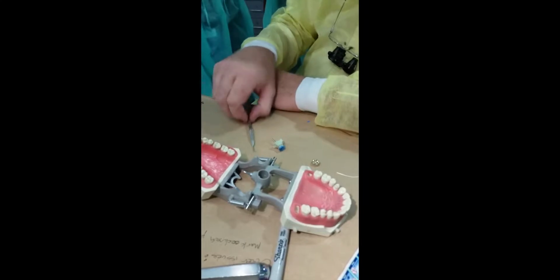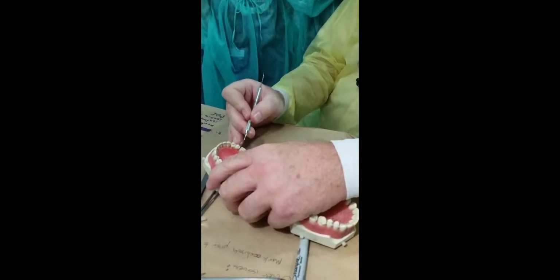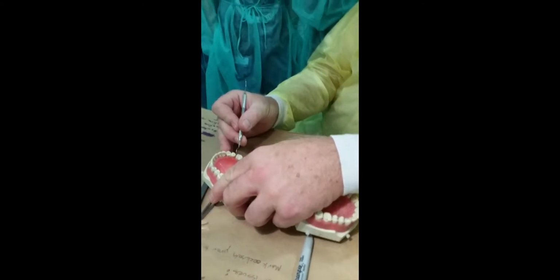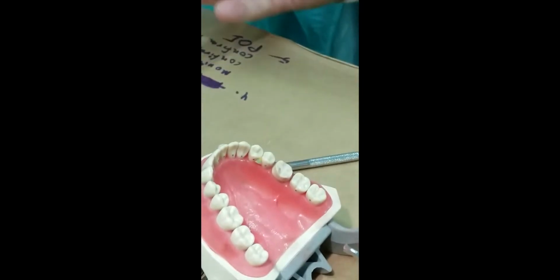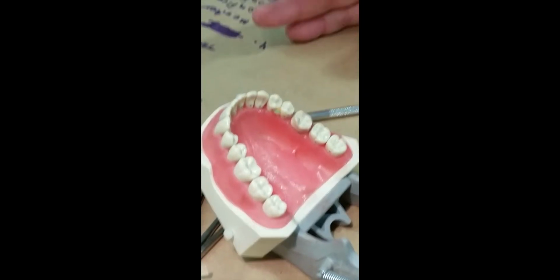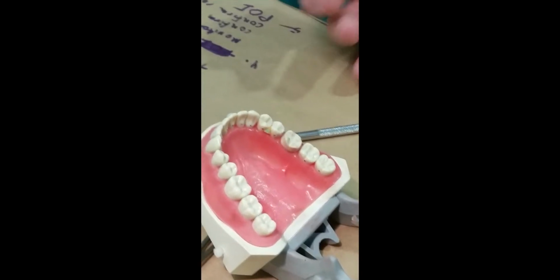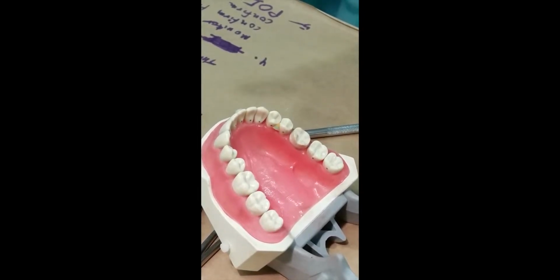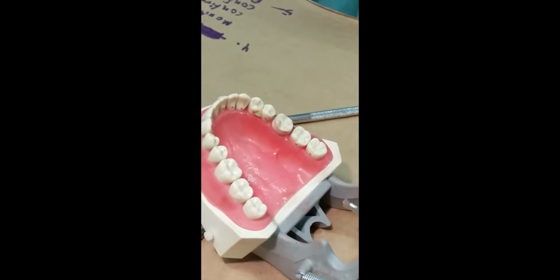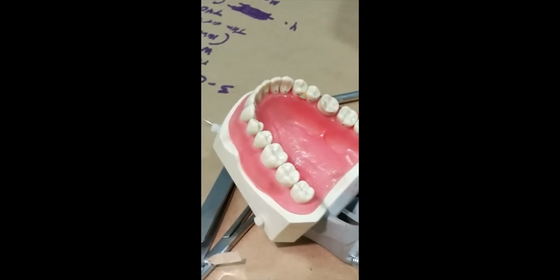And then if there's something that won't clean off, you have a little proximal temporary cement or that sort of thing, you can get it with an explorer and scrape it out. If you have an MOD, you're almost certainly going to have to get into the line angles and clean it out. One of the reasons we use the Tucker technique for inlay cementation is there's no cement to clean out. So if you're looking for perfect margins where there's no residue of temporary cement, you don't ever put temporary cement in there. So you have a temporary that leaks, but you have something that doesn't interfere with the cementation.